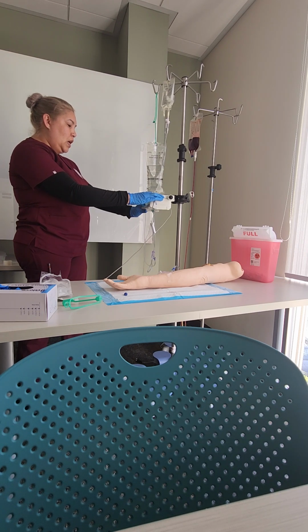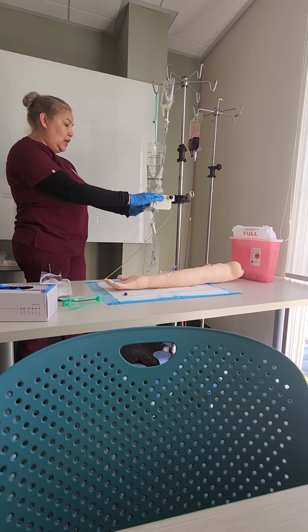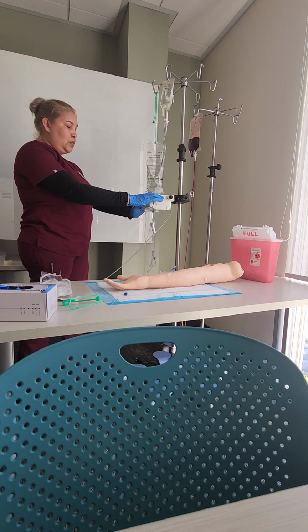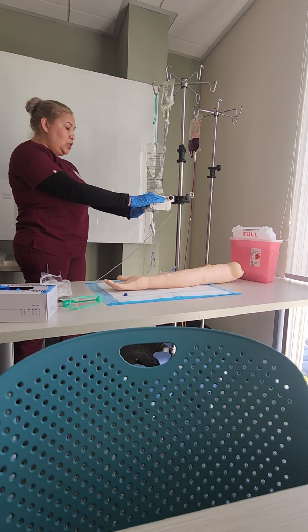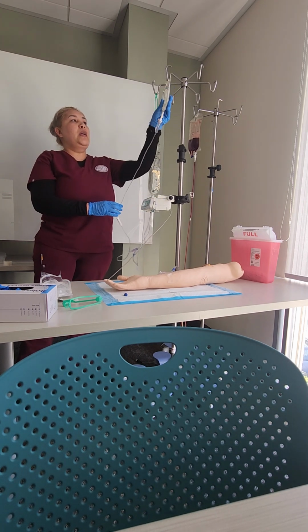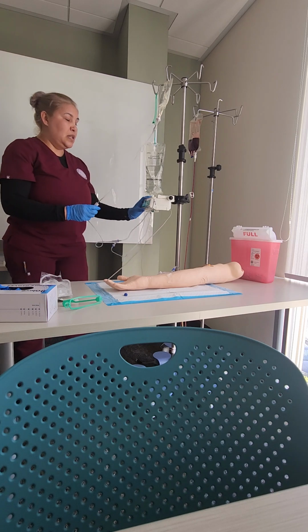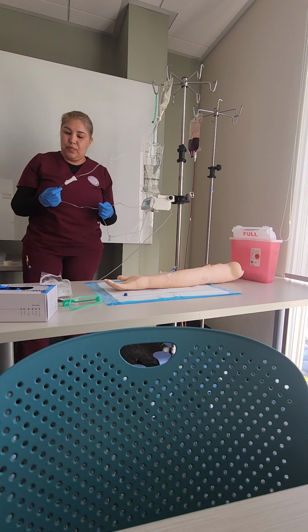Okay, so here we go. I have to maneuver through and find my secondary, say okay. Do I want to set a new secondary? Yes. Use dose rate calculation? I want to say no. I'm going to manually put everything in. I know that my volume to be infused is going to be set at 200 mLs, and that's going to be for 30 minutes.